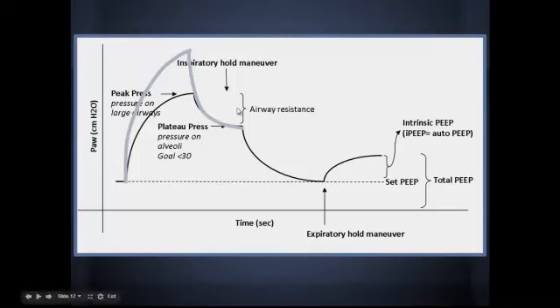And while high plateau pressure can indicate some risk of barotrauma, there really isn't a specific risk of barotrauma with high peak pressures as long as it's isolated and the plateau isn't high as well. And this difference between the two is a measure of the airway resistance, which of course is going to be very high in an asthmatic.